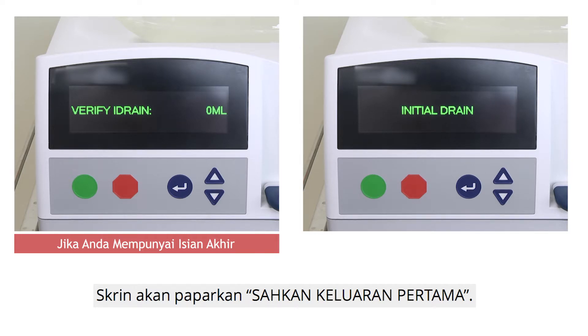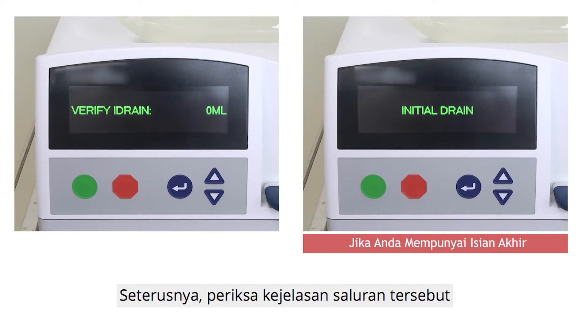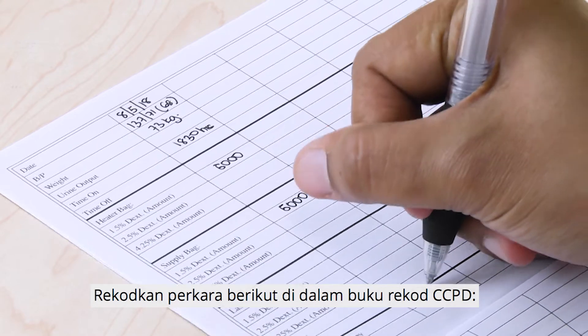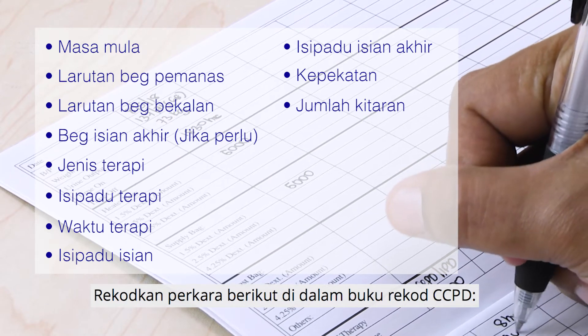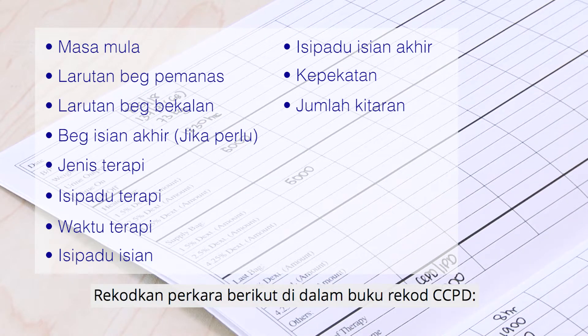Press the green button to begin your therapy. If you do not have a last fill, the screen will show 'Verify I Drain.' If you have a last fill, the screen will immediately show 'Initial Drain.' Check the clarity of the drainage. If you do not have a last fill, with the screen showing 'Verify I Drain,' press the green button — after which the screen will show 'Initial Drain.' Record in the CCPD Record Book: time on, heater bag solution, supply bag solution, last fill bag (if applicable), type of therapy, therapy volume, therapy time, fill volume, last fill volume, concentration, and number of cycles.